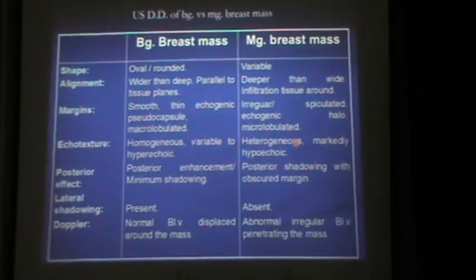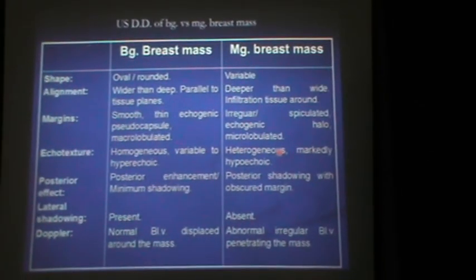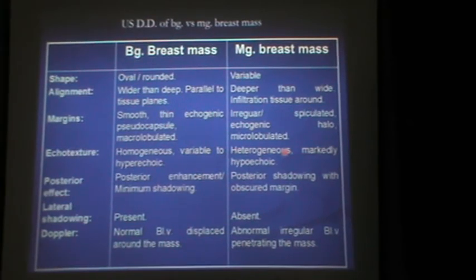Ultrasound differentiation of benign versus malignant breast masses. By ultrasound, the shape is of benign.